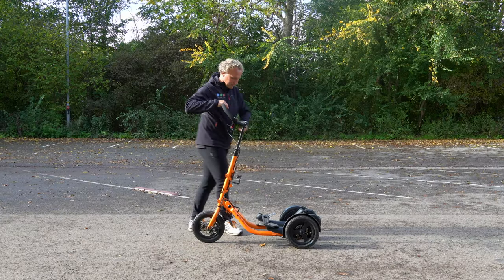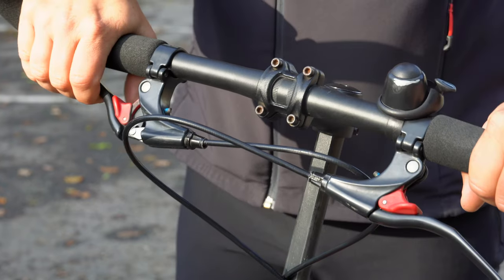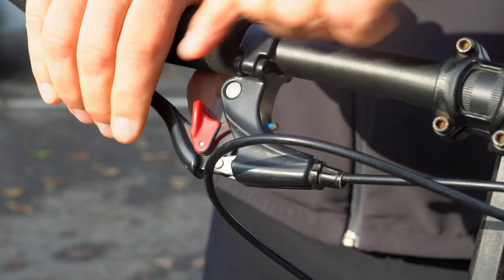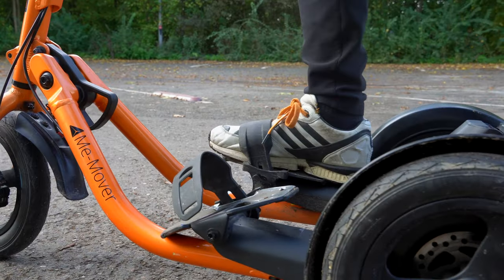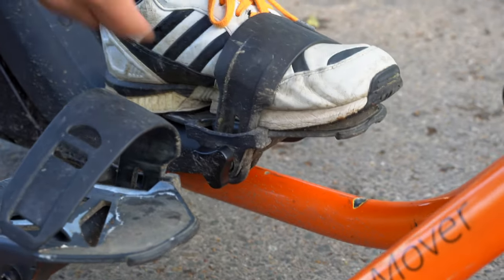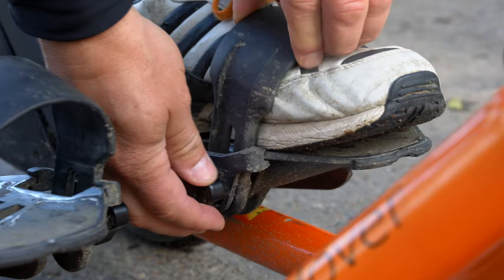Once you've adjusted the height of the handlebar, it's time to adjust the pedals. Make sure the parking brakes are engaged so you can safely adjust the foot straps without your MiMover moving. Stand behind the MiMover and adjust the foot straps one at a time. Your feet should be evenly distributed on the pedals, and you're looking for a snug fit with light pressure on the top of your shoe while still allowing it to easily slide out.